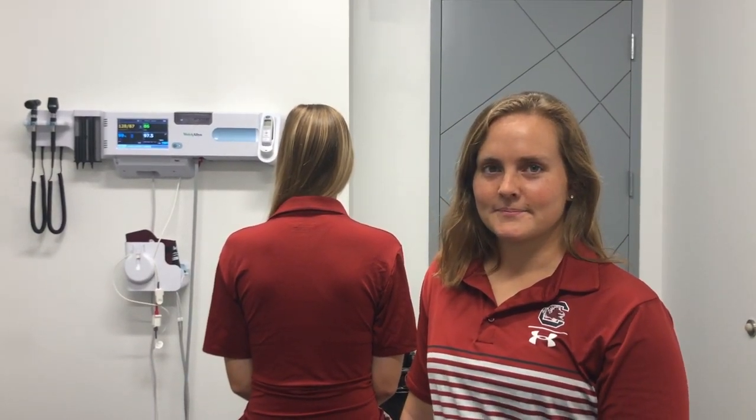Hi, my name is Jira Schuler and I'm a third year athletic training student at the University of South Carolina, and today I'll be going over lung auscultations on the posterior side.